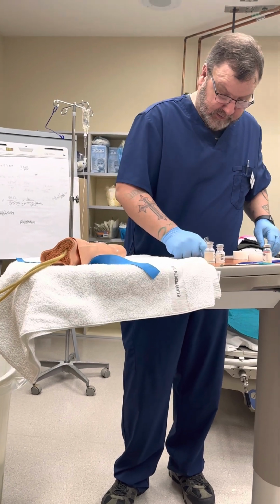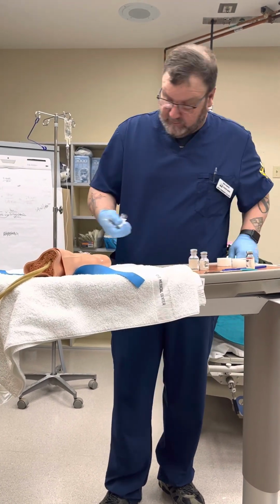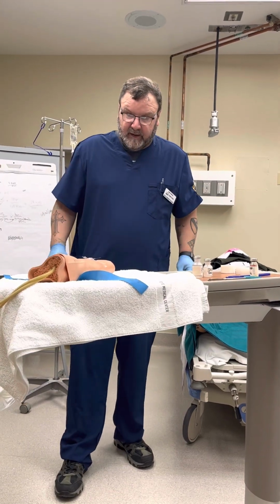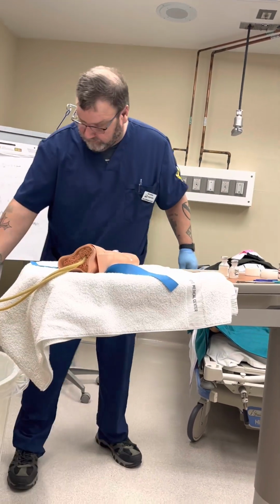We've given our medication. We can now document that we gave the medication in our chart in DocuCare, which is my favorite. I can't wait to do it.